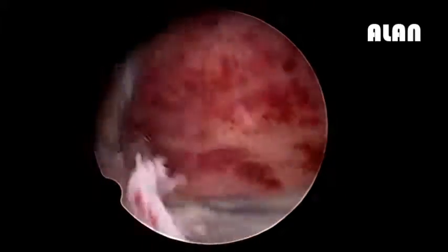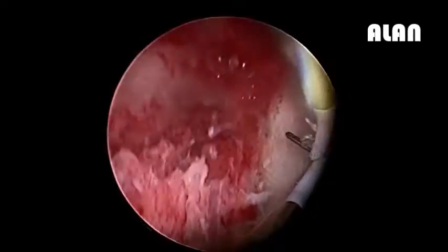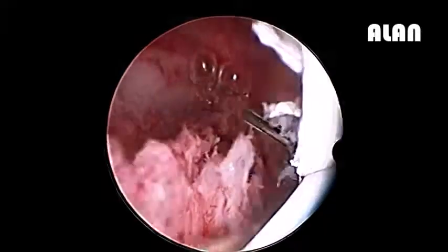Will she require second look hysteroscopy, sir? You can do an office hysteroscopy for her if you want, but I think she should be left alone — she will conceive very well, like other Mullerian anomaly cases.